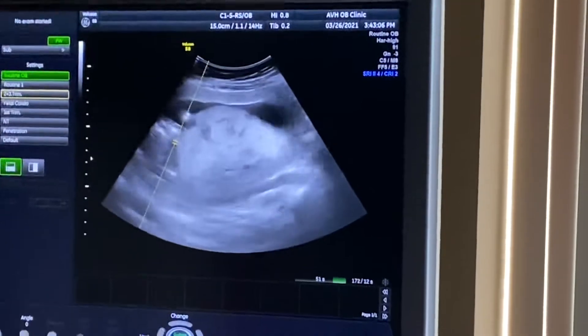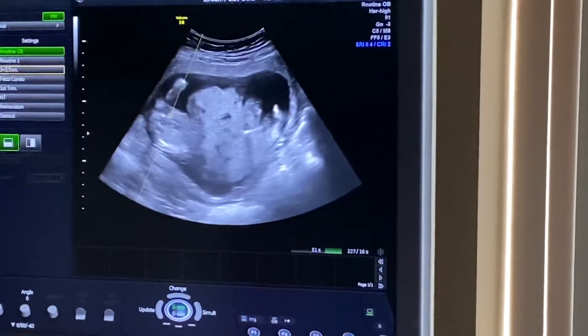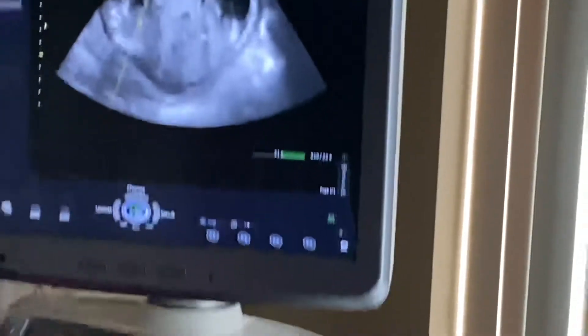He's just kind of laying in an odd position, so just got to try and get past... There we go. You see that flutter? There's a hand, but do you see the flutter right in the middle? It's moving. You see that right there? That is the baby's heartbeat.